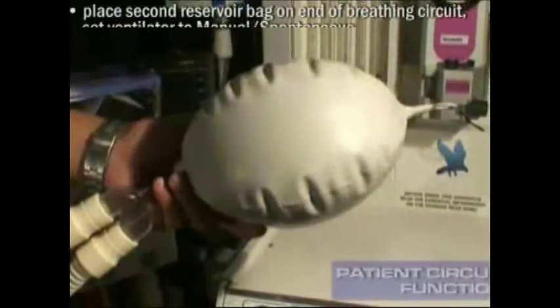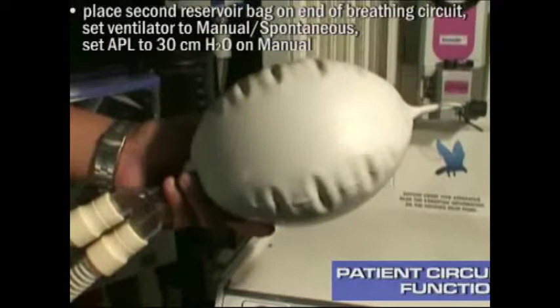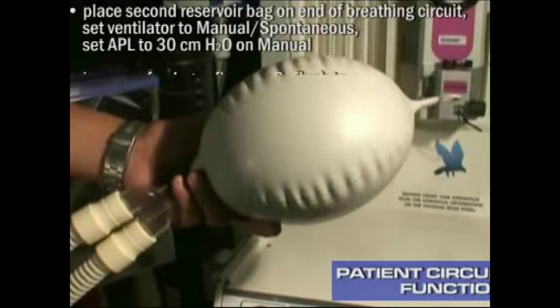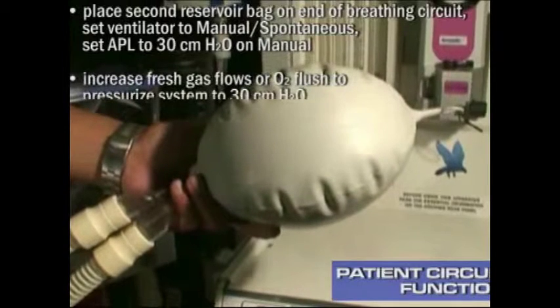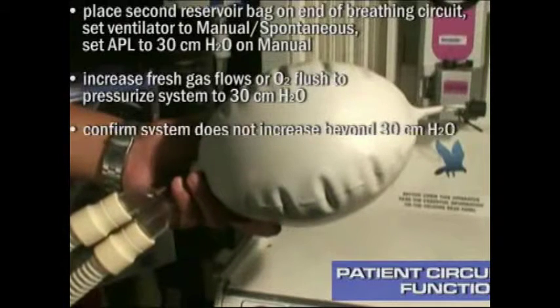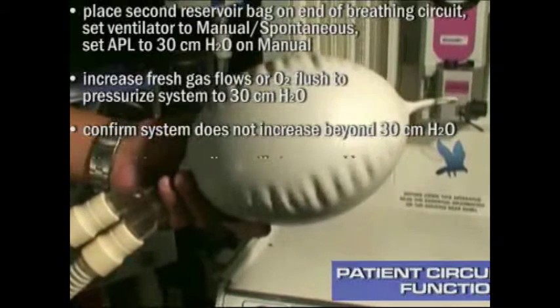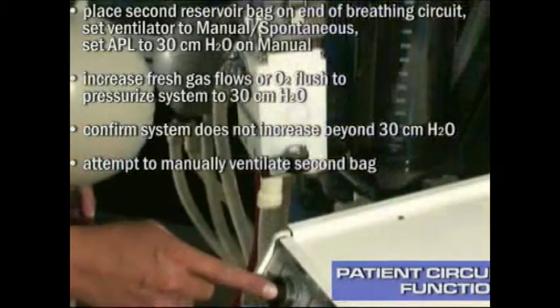Place second reservoir bag on end of breathing circuit. Set ventilator to manual spontaneous. Set APL to 30 centimeters H2O on manual. Increase fresh gas flows or oxygen flush to pressurize system to 30 centimeters H2O. Confirm system does not increase beyond 30 centimeters H2O. Attempt to manually ventilate second bag.